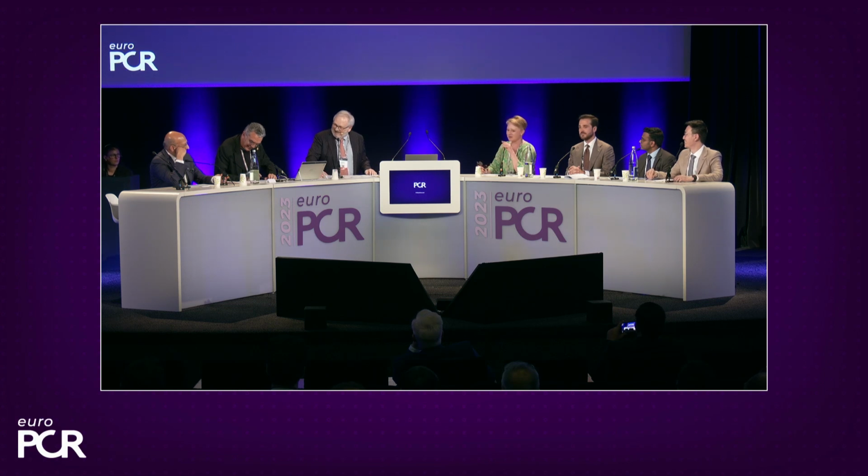You had a question for Joanna, how she's going to treat that vessel. The treatment has been laid out perfectly for us. So I think the key here is that based on the angio, I would say the circumflex is not so sick. Calcifications are mild to moderate. I would probably go for predilation, a provisional strategy with one stent from the left main into the LAD. Of course, protect the circumflex branch and hope that it will stay open, given the almost 90-degree angulation, and I would have a bailout strategy with maybe TAP technique at the end.